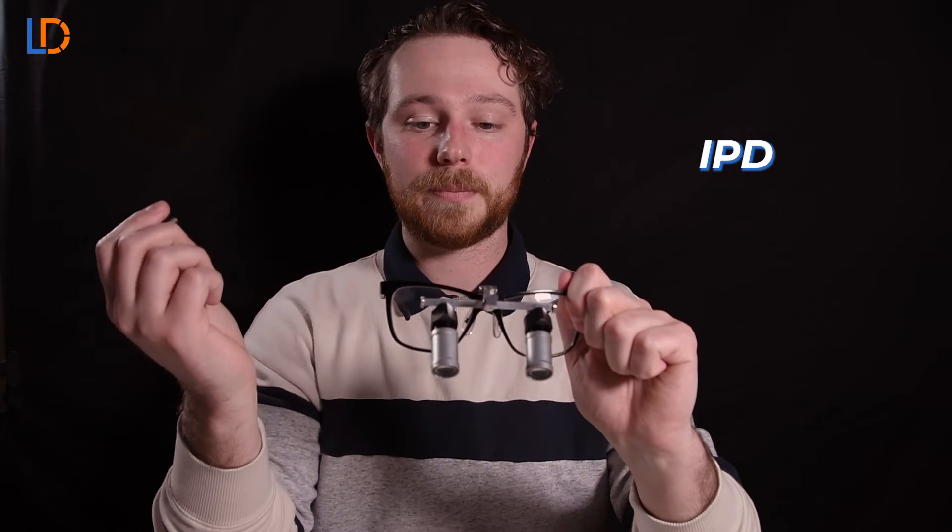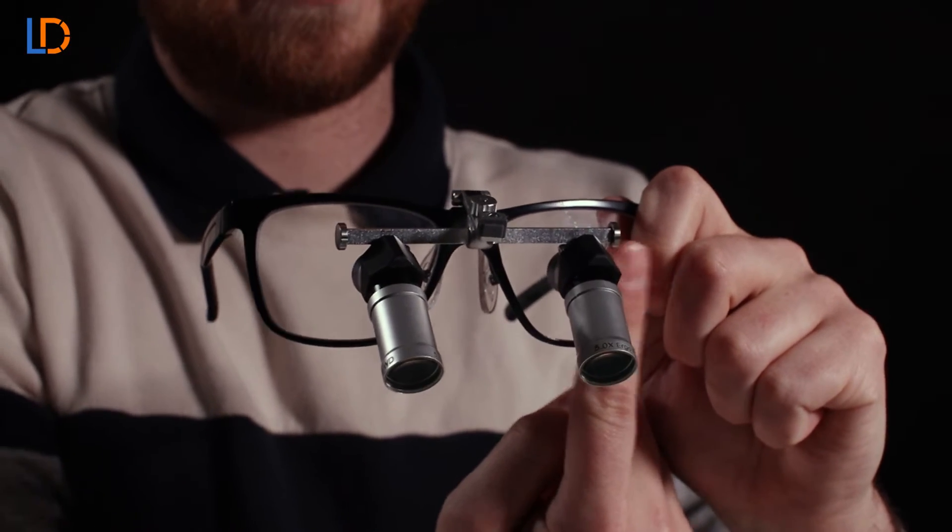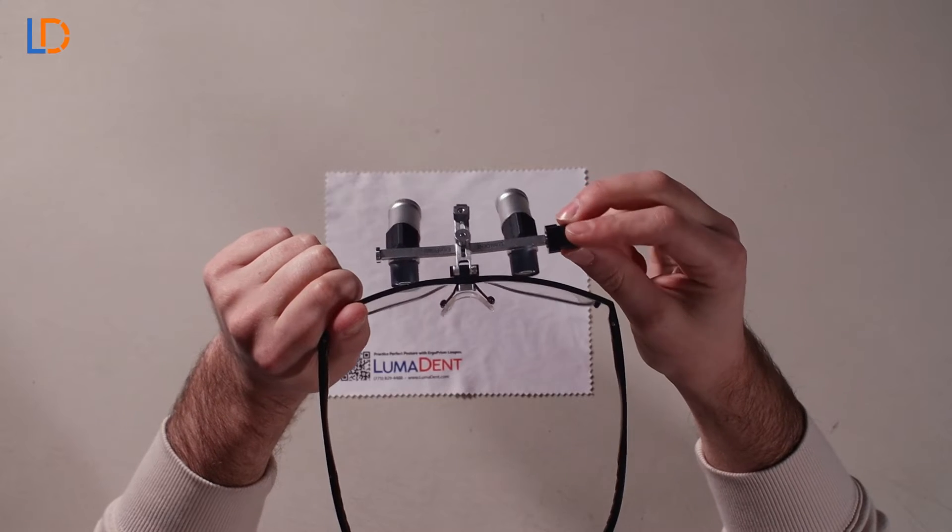The next step is going to be adjusting the IPD. To adjust the IPD you're going to want to take that tool and adjust the screw on the right and the screw on the left. Just put the tool on.